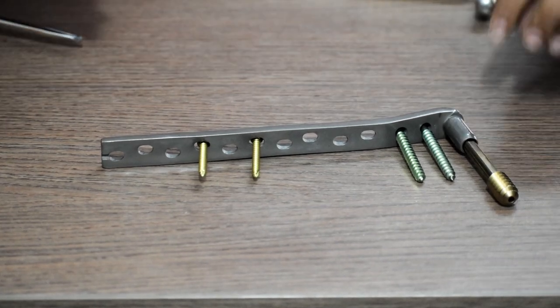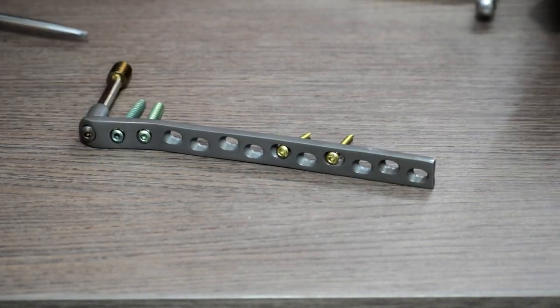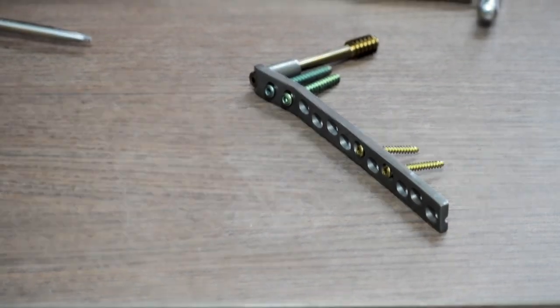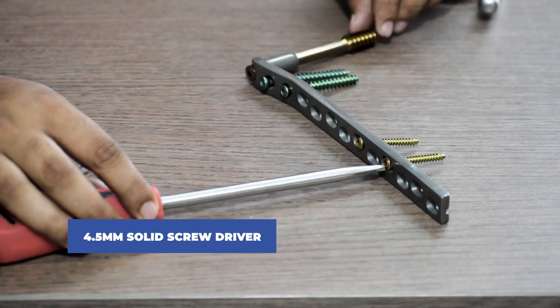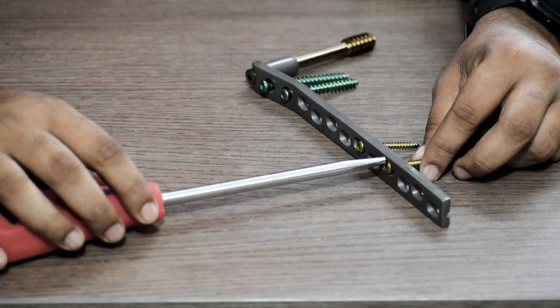Now let us understand the removal process of this plate. Firstly we will use a 4.5 mm solid screwdriver and remove all the screws one by one.